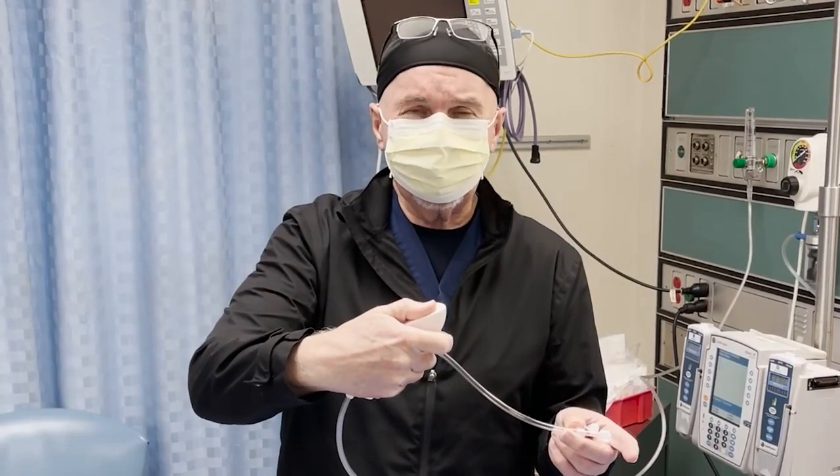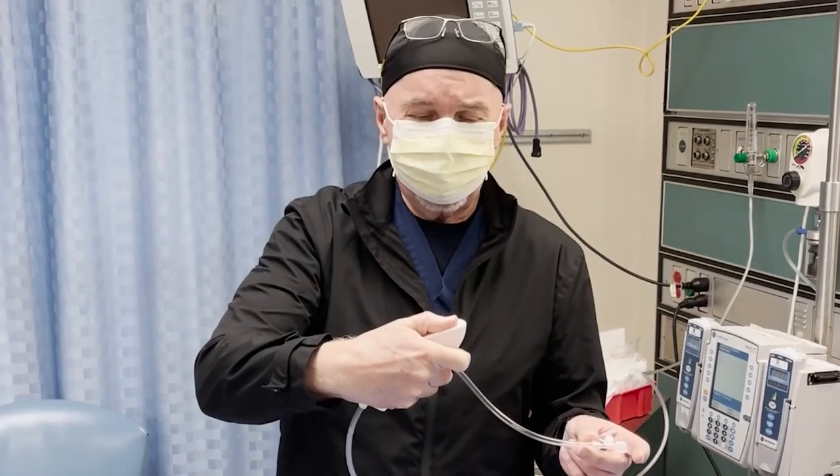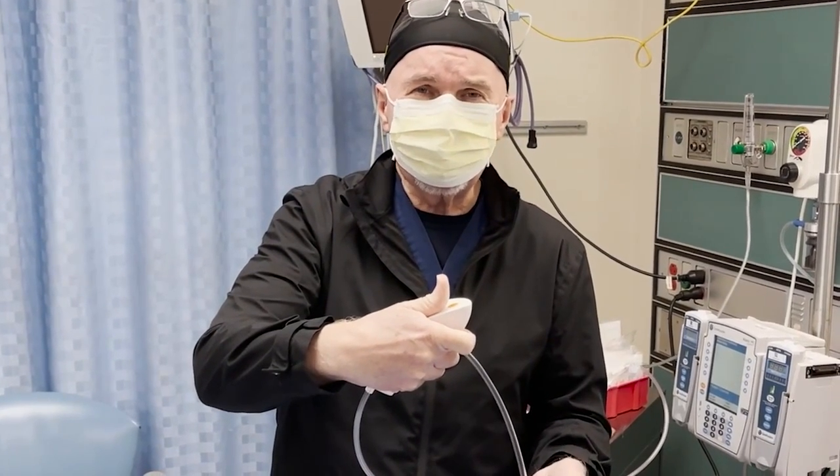I have my thumb and finger covering the holes. This is then blowing air in. If I take my thumb up, then it sucks the air out so you don't get barotrauma.